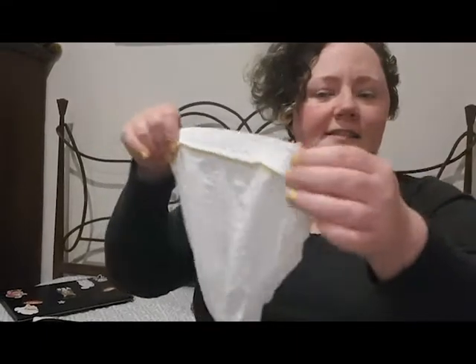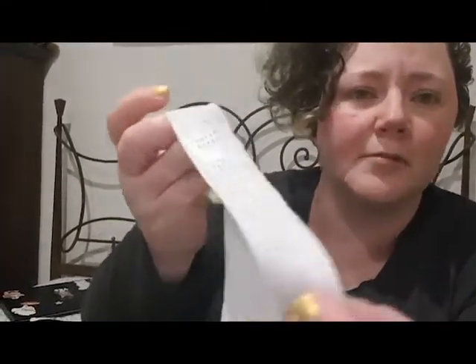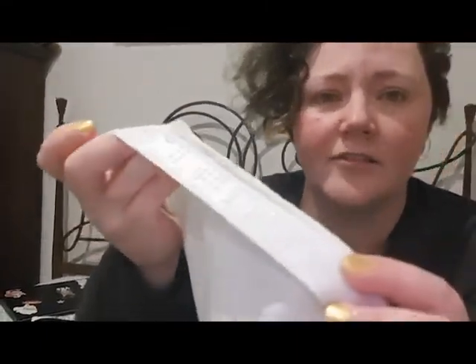You'll notice that it has an elasticky top. You can see a little bit of a shine there on the elastic. That is an anti-slip thing, so that is to stop it from sliding down your leg. It also has this section.